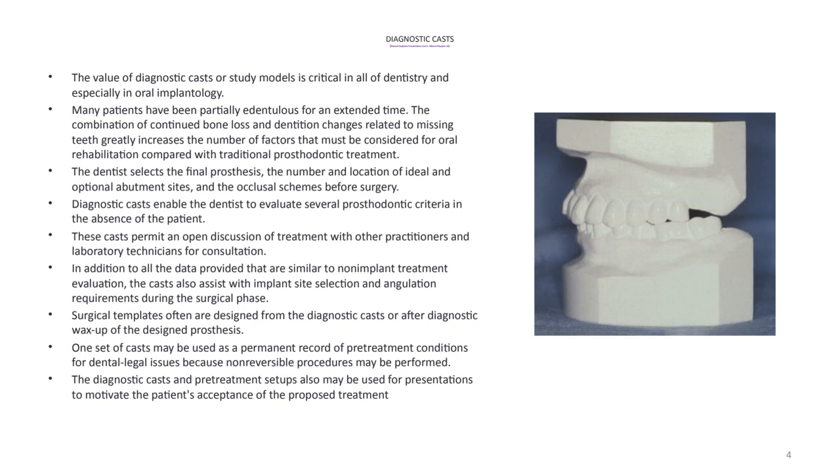The value of the diagnostic cast or study models is critical in all dentistry, and especially when we're talking about dental implants. Like we said, many patients have a partially edentulous area for a longer period of time, and that means that the bone has shrunk, it's resorbed, and there are changes in the position of the natural teeth, if there are any there. Like I said, the teeth might move.